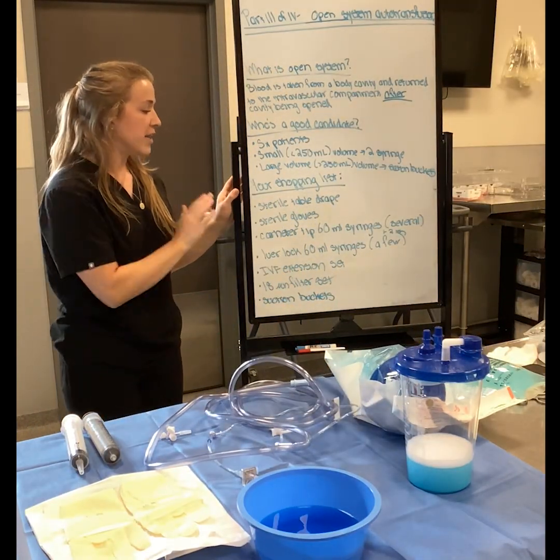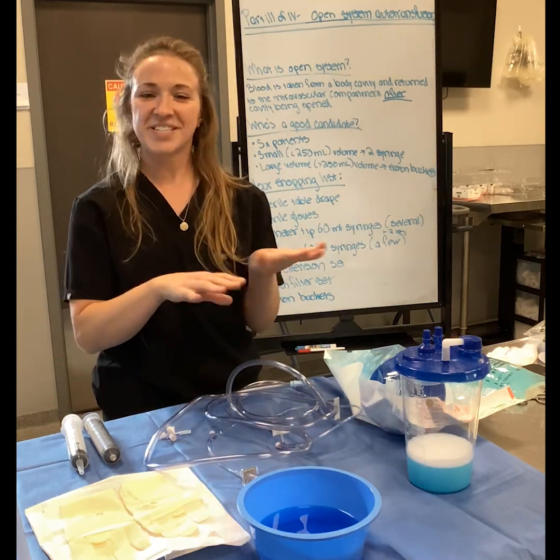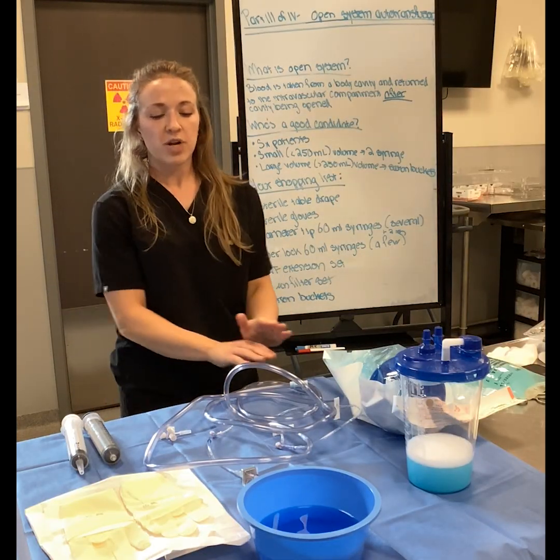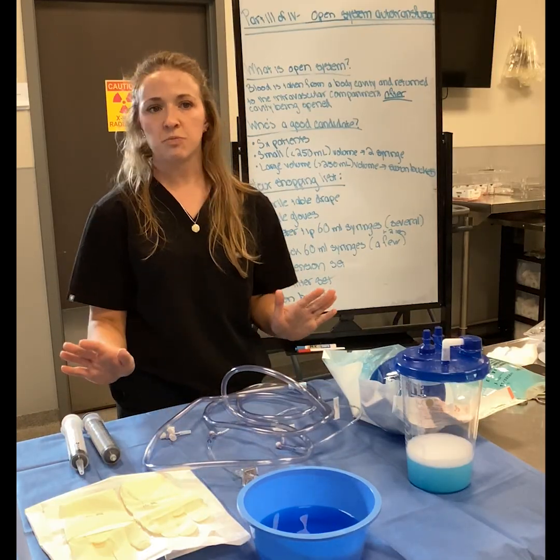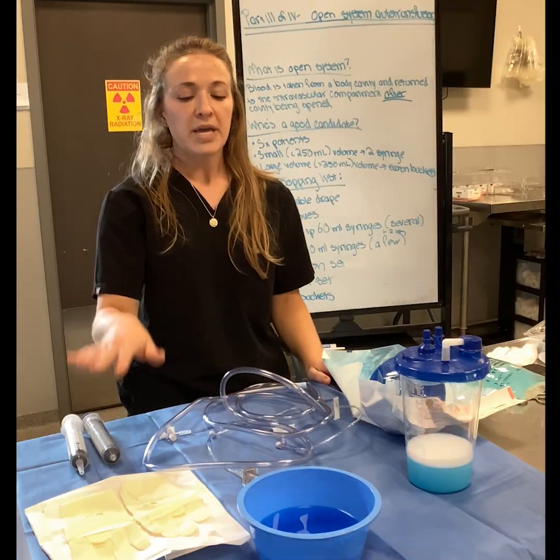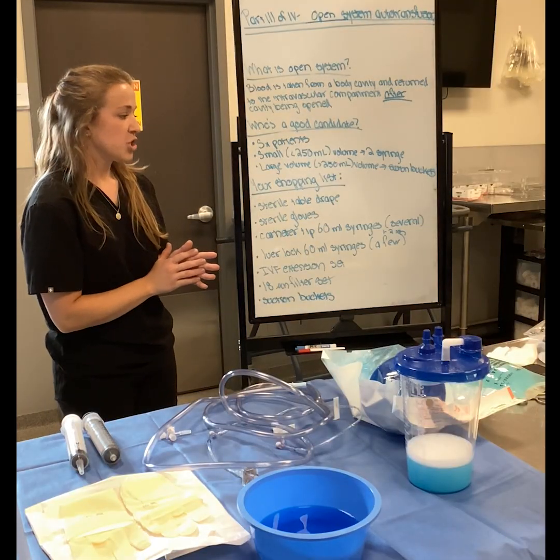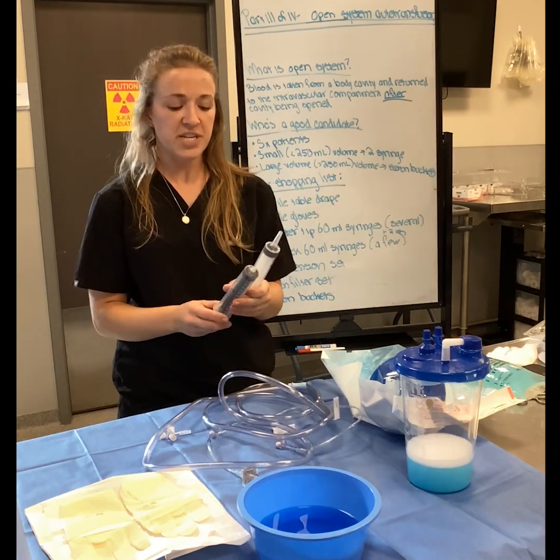I usually prefer to work off of some type of sterile quarter drape or sterile table drape. So you can have a wheeling stand with you. You can put this on a prep table. You just want to make sure the area is as clean as possible, maintaining asepsis the absolute best way that you can. Sterile gloves. Again, if you are transferring a culture medium, you're transferring blood somewhere, I would strongly recommend the use of sterile gloves.